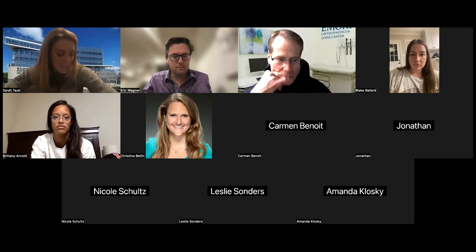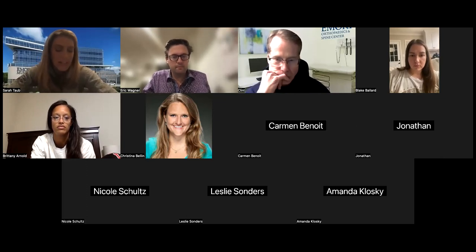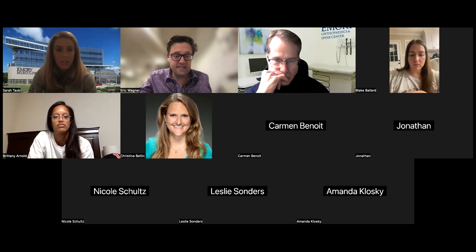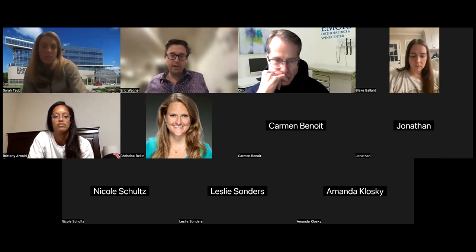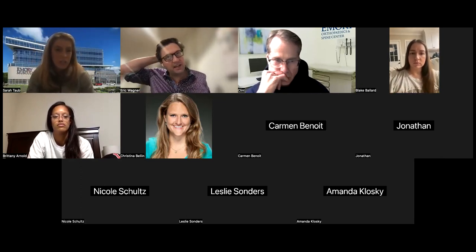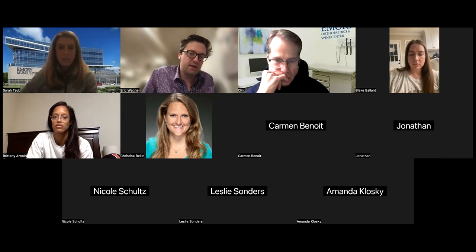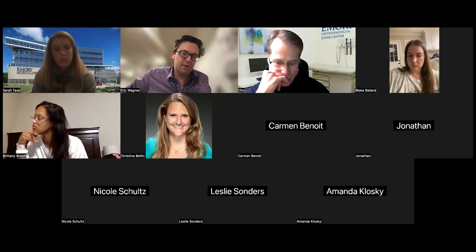I have a question. If someone comes in with the light bulb sign and they're not able to move their shoulder, what other views are you trying to order? So ideally you get an axillary. But if they truly can't get an axillary, they're probably locked like this. They're probably sitting internally rotated with their arm either on their chest or right by their side. So potentially they can abduct a little bit in the axillary.